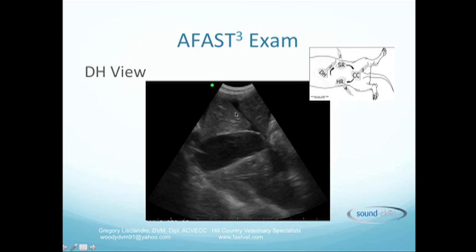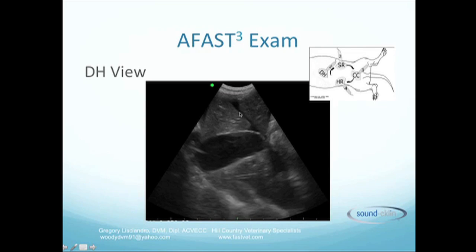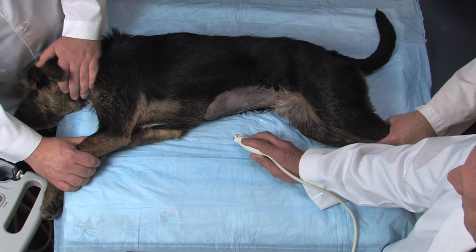This patient is positive — you can see a liver lobe and these anechoic black triangles. Anechoic black triangles are the easily recognizable ultrasonographic findings in FAST exams for free fluid. Here we are at the DH view.